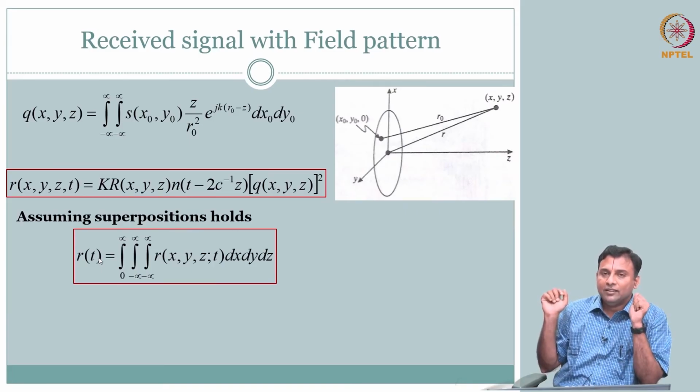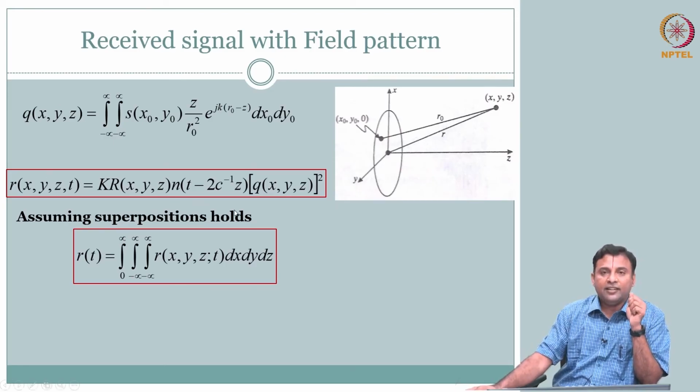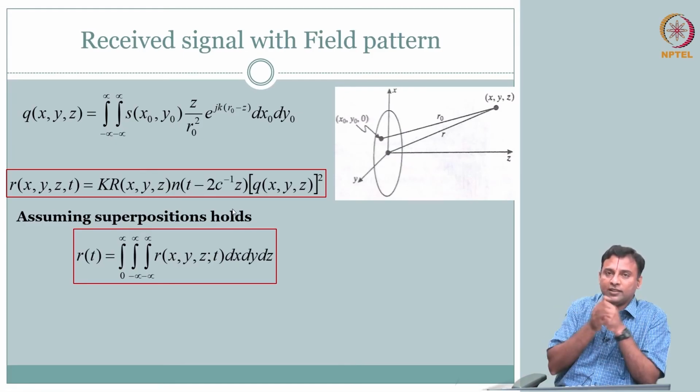Okay. So, now the question is, if we talk about locations in the z direction, can we make some analysis to find out how the equation can be simplified, or is it the same equation? If z is close to the transducer, what are the effects?